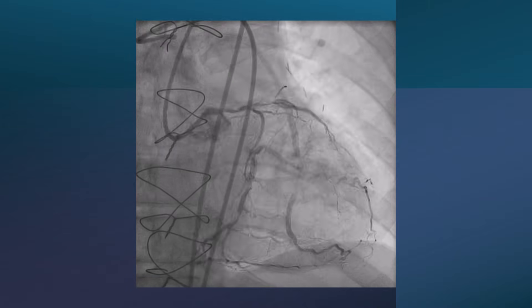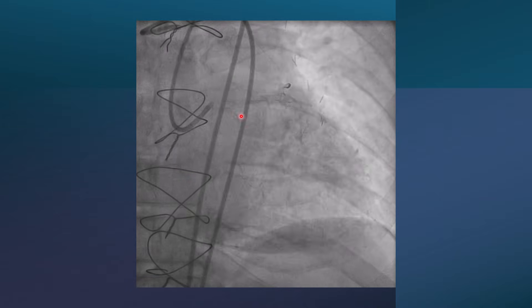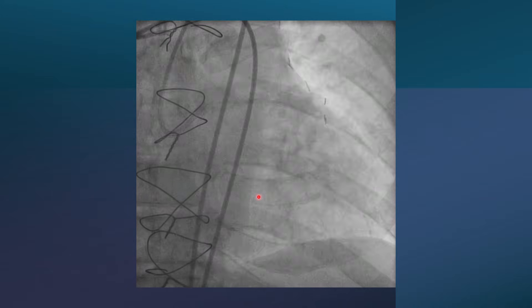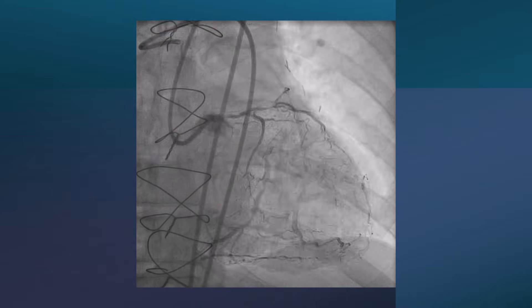This is a bilateral injection showing the proximal part of the circumflex — a large vessel with multiple lesions. On the still image, there is a long CTO lesion of more than 20 mm; the stump appears tapered. There are two more lesions after the CTO, and the OM is a branching vessel with stenosis both before and after the anastomosis.